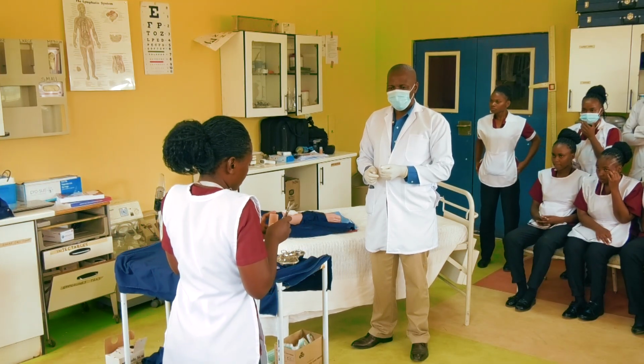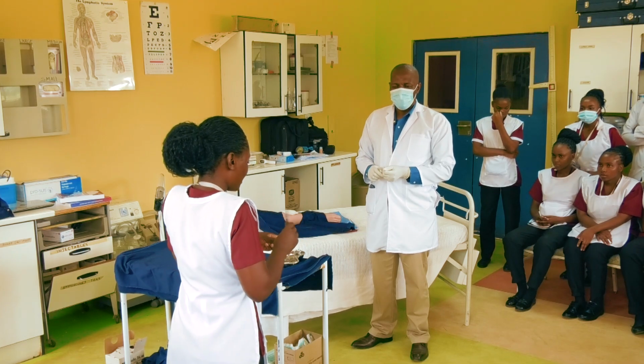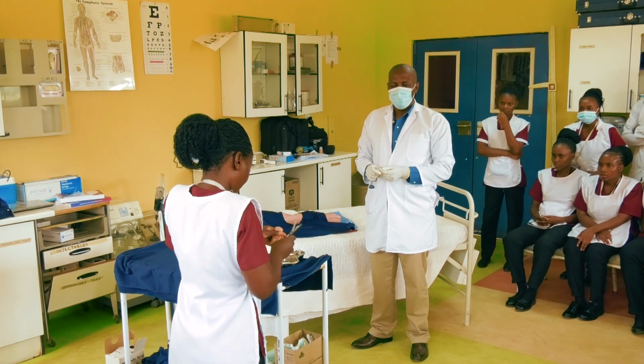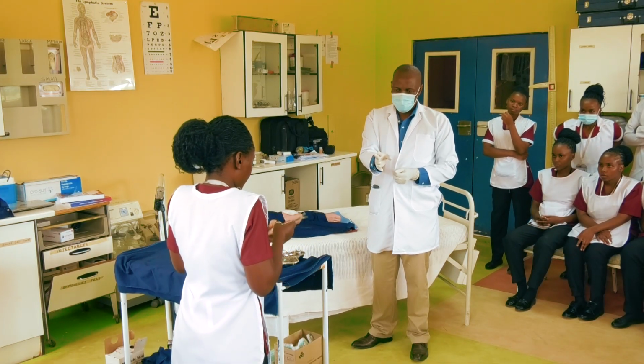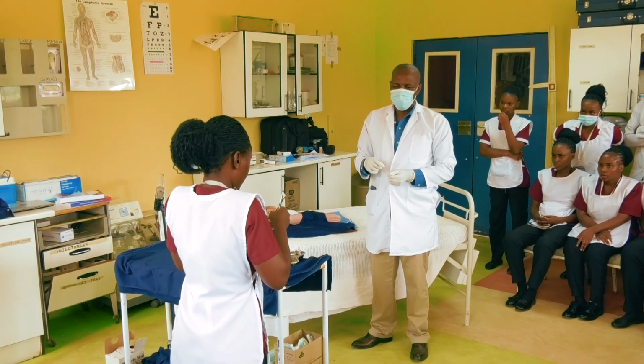My assistant will go to lumbar puncture next time in the next 2 weeks. So you will still be my assistant and I want to see improvement in my assistant. So just cut with the scissors, cut a bit so that you, yes. And then go all the way.